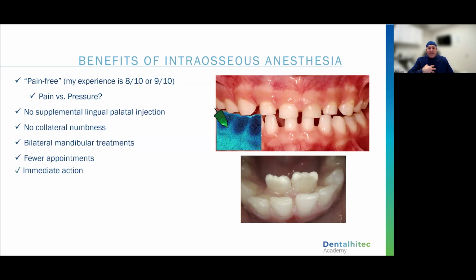Everybody wins. For those of you that are new to intraosseous delivery of local anesthesia, it took me a little bit of time to realize that it really is immediate, profound anesthesia in that area that you are delivering. I didn't believe it at first. It took me a little time. When I gave that IO injection, I would wait a little bit just because I needed to feel better.